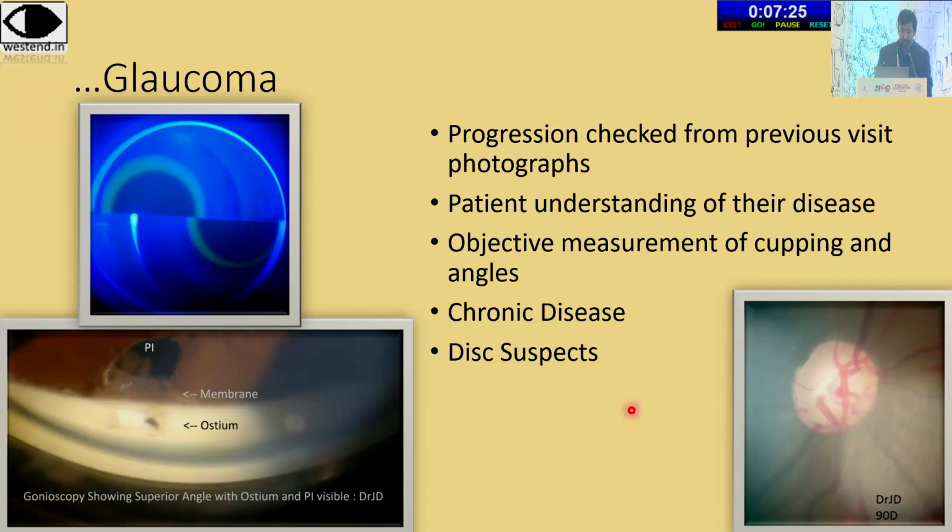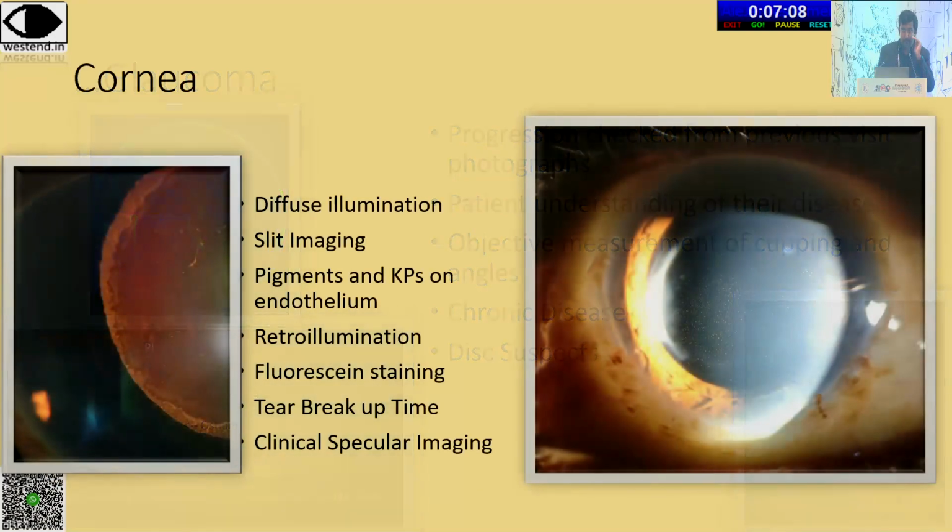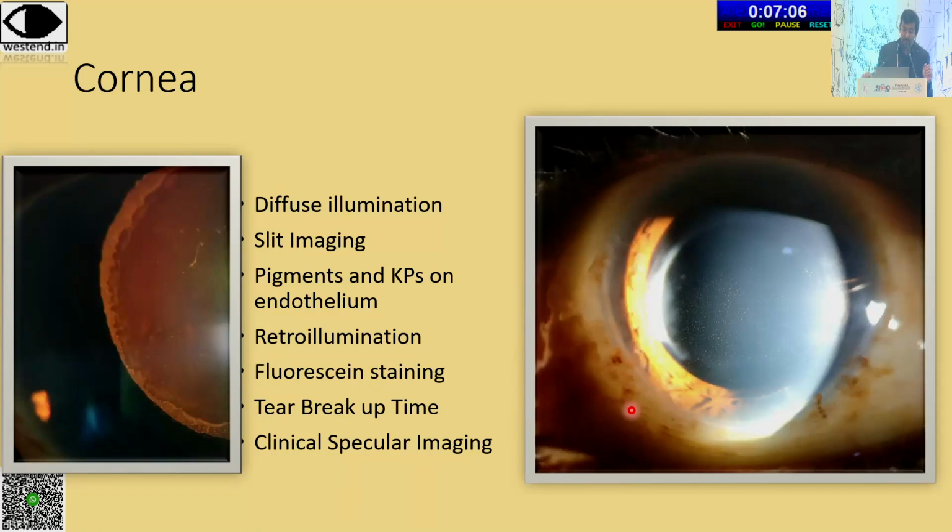And of course, it's very important in disc suspects. So I always give a photograph of the disc to the disc suspects and tell them, see, keep this safely with you. Put your name on it, put it in your email, so that next time I see you, you should show this to me. I always have a backup, but when you give them that responsibility, they take care of their health.